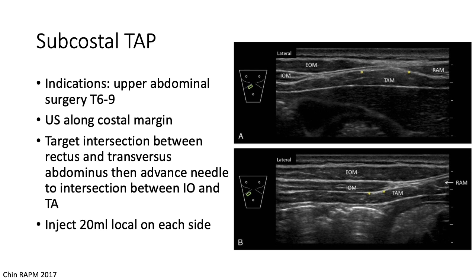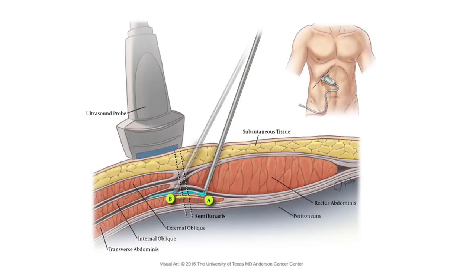If the needle is in the correct plane, the fluid will travel into the transversus abdominis plane between the internal oblique — similar to the lateral TAP block. You can use a total of 20 mils of local anesthetic. The probe is placed obliquely along the costal margin; starting medial toward the midline, scan lateral until you see the transversus abdominis plane come into view below the rectus. The bottom image shows the needle injecting local into the correct plane.